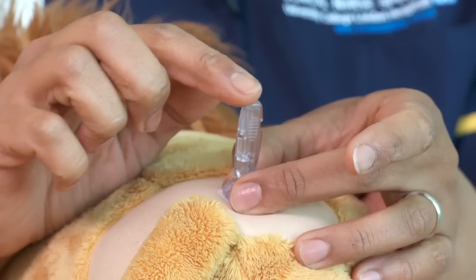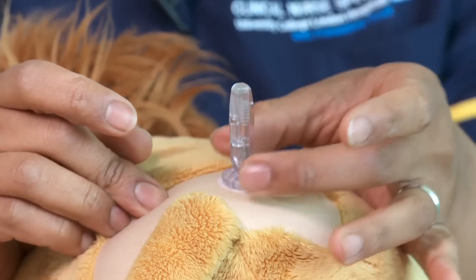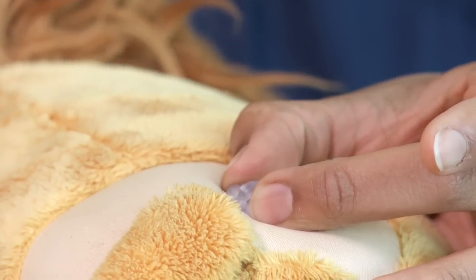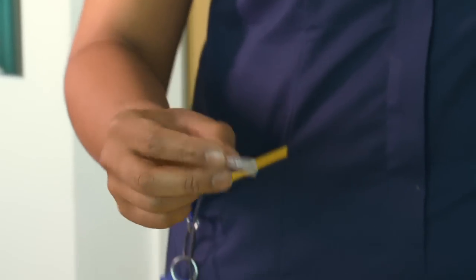Now we need to remove this part, which contains the needle. Hold the sensor down firmly in place and pull away. Your needle is now safely contained inside the inserter, so put that into the sharps bin.